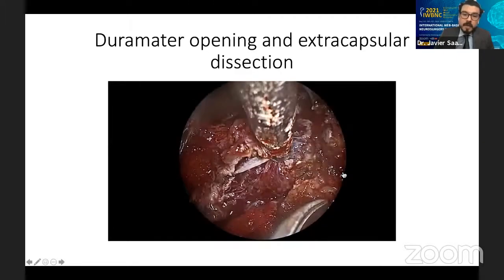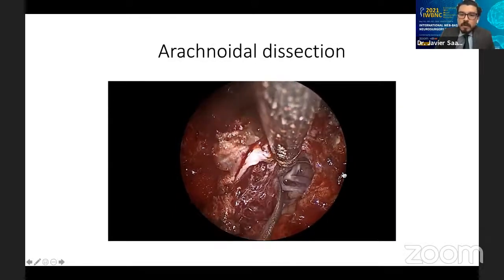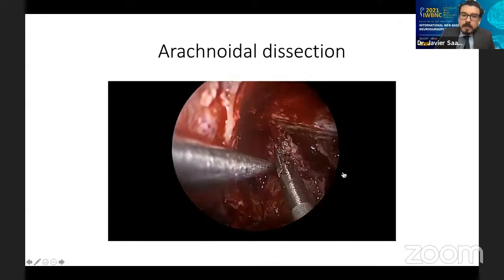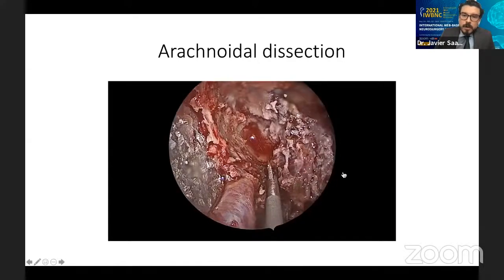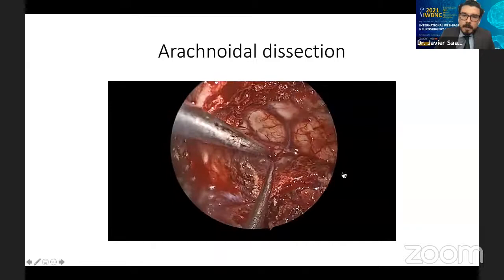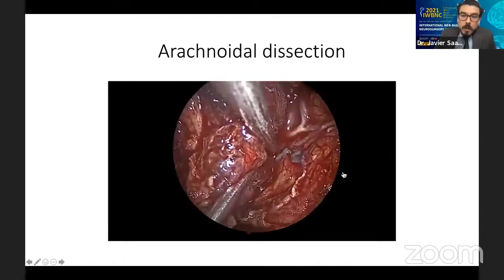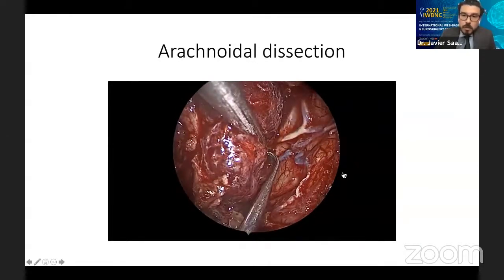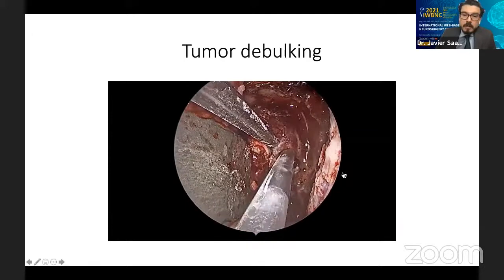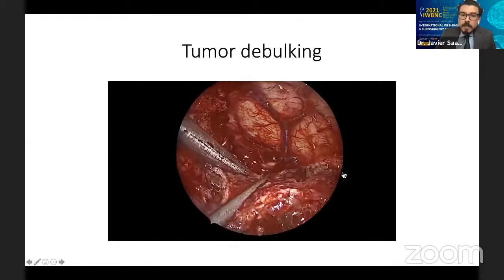We proceed as usual with any tumor. Perform the dissection of the tumor out of the brain parenchyma. We cut all this compromised dura. Just medial to it is the cavernous sinus. We keep dissecting the tumor from the brain, and as you can see, there's no brain retraction. All the retraction we are doing is on the tumor. We proceed as usual. We perform the debulking of the tumor. We're making the dissection easier. Keep dissecting the tumor progressively.